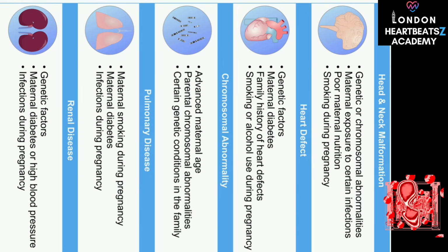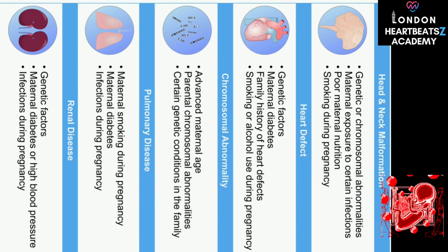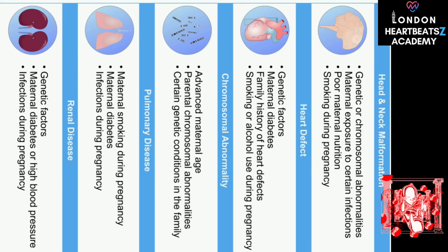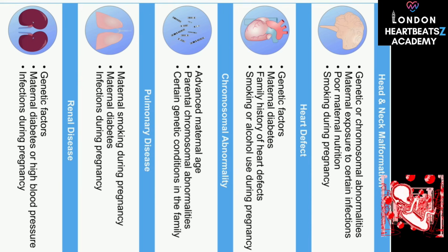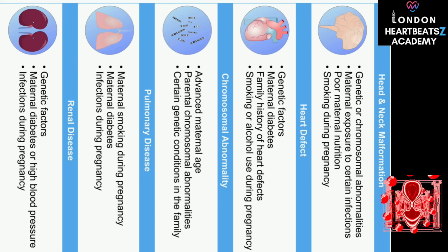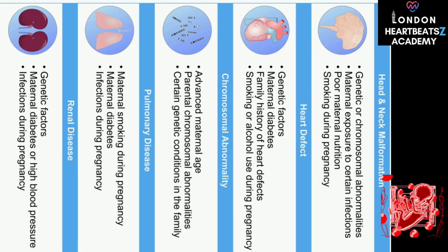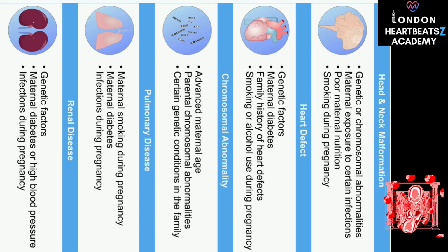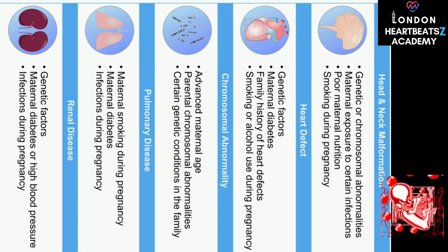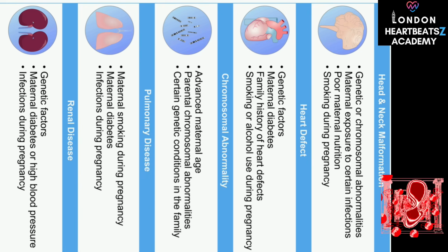18 to 22 weeks? Why that specific window? Well, there's a good reason for that timing. By this stage, the fetus has grown large enough, and its anatomy is developed to a level of detail where most major structures can be clearly visualized and assessed. Okay. And at the same time, there's typically still plenty of amniotic fluid surrounding the fetus, which acts as a kind of natural window, allowing for clearer ultrasound images. Right. So it's that sweet spot where development is advanced enough to see properly, and the imaging conditions are usually pretty optimal.